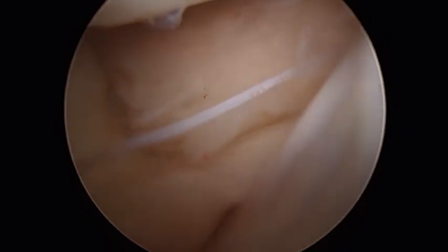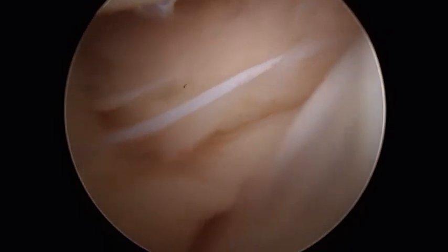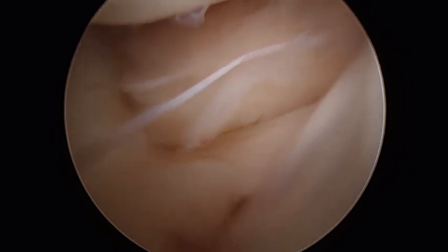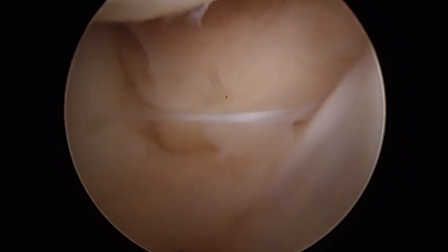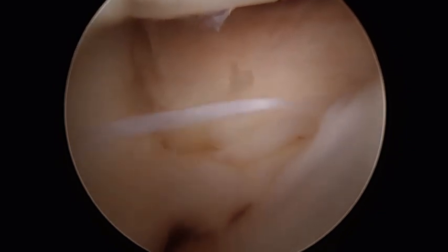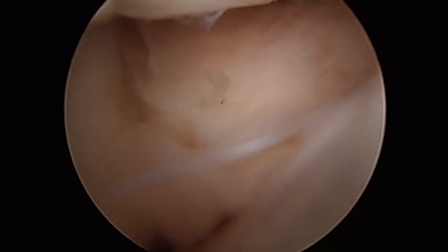To identify the lesion, the arthroscope is positioned at meniscocapsular junction and using suction to drain fluid from the joint, followed by pumping the fluid at the junction. The pressure of the fluid at meniscocapsular junction can accentuate the meniscocapsular separation, as in this case.